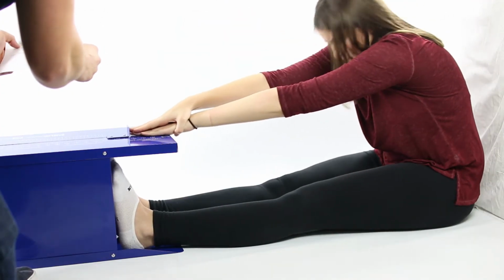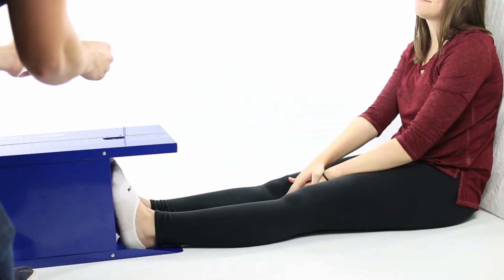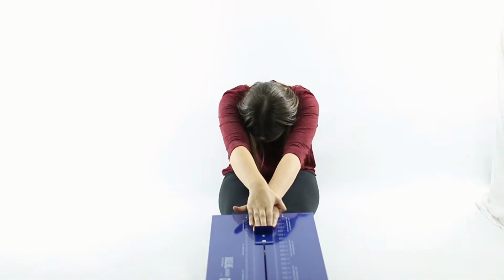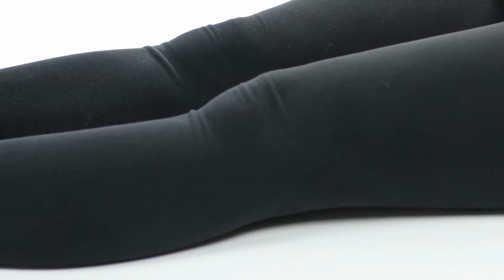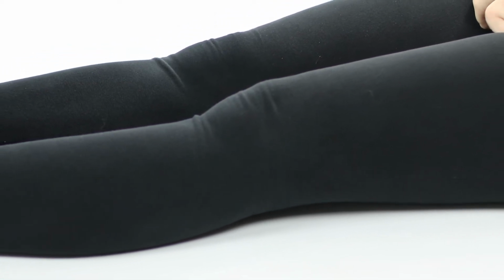Instruct the subject to place one hand on top of the other with his or her palms down and reach as far as possible. The head and back can come off the wall, but the back of the knees must be kept flat against the floor unless you're using the back saver method.